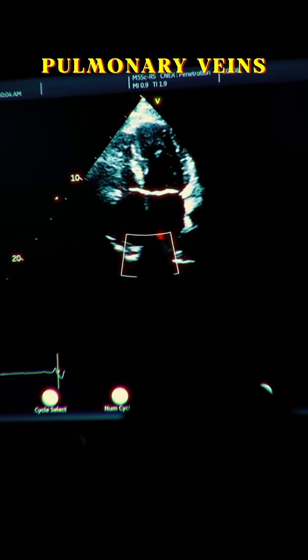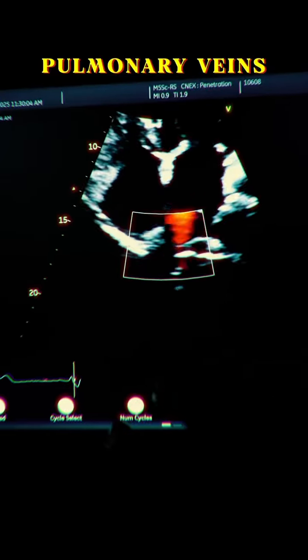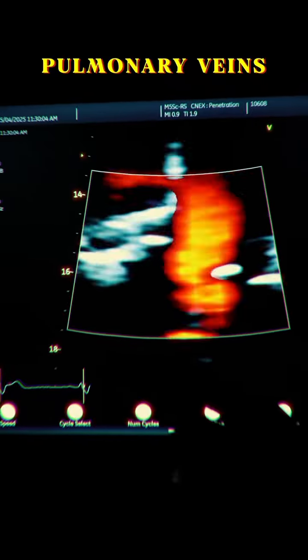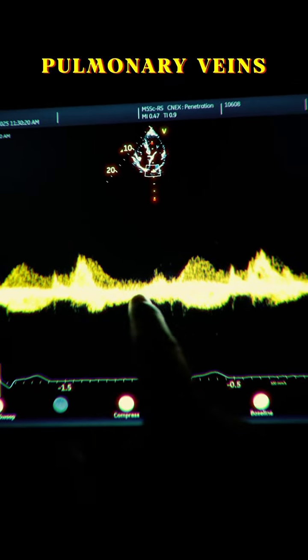An important measurement of diastolic dysfunction is going to be our pulmonary veins. In the event the patient had moderate to severe mitral regurgitation just from color flow, we can pulse the veins to look for any flow reversal and then grade it as severe.